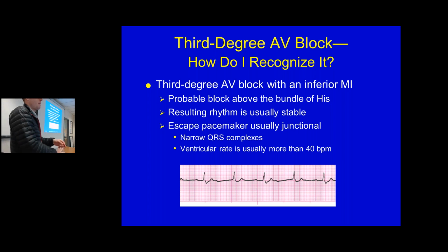I have a question. Yep. I don't know if this goes with this, but you'll get some variance with marching it out. How much is considered too much? You mean variance in the distance? Yeah. You shouldn't have more than like 1 or 2 boxes. But like I said, sometimes it's hard to identify them because they'll be buried, right? Yeah. So you take a distance where you know where the P wave is, and then you can march it out there.